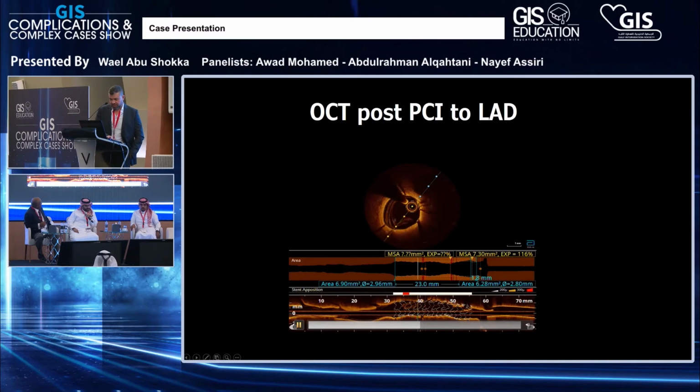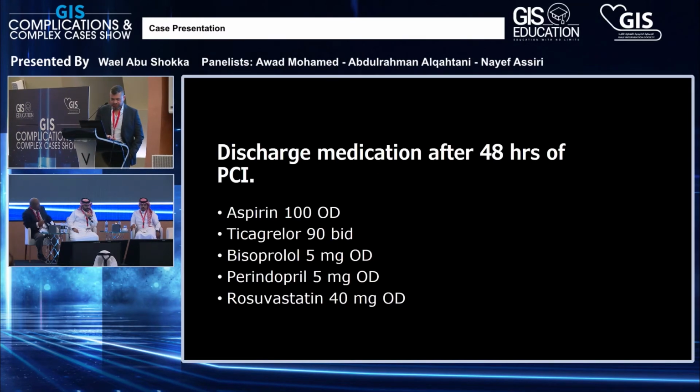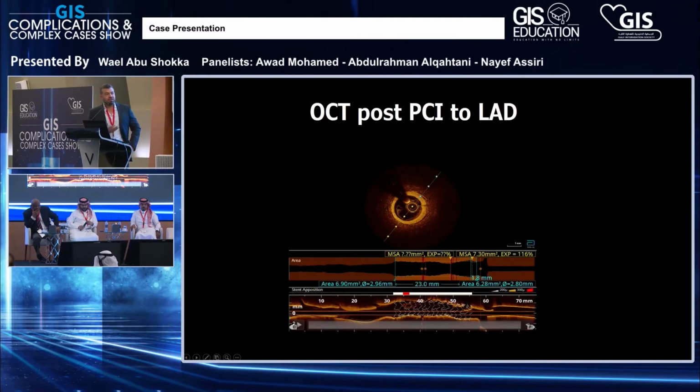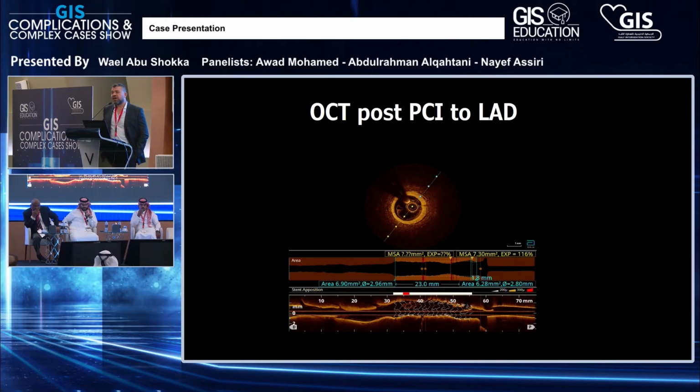Look, it's not going to be 100%. You can never get 100% expansion. 80–90% is acceptable. In most cases, this is what you're going to end up with, and I think this is an acceptable result. Even the new OCT from Abbott, 90% is acceptable.